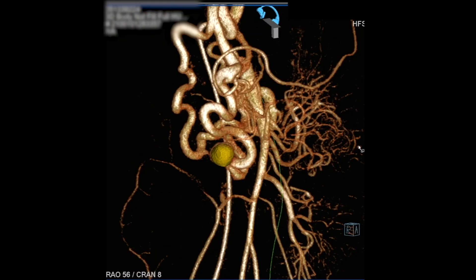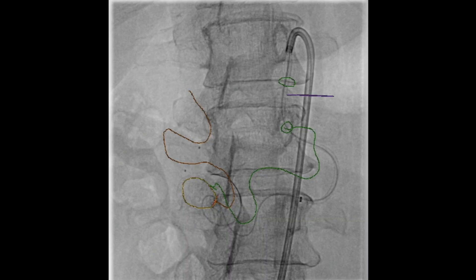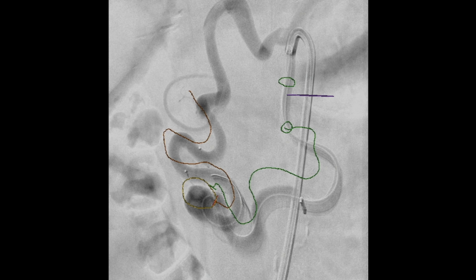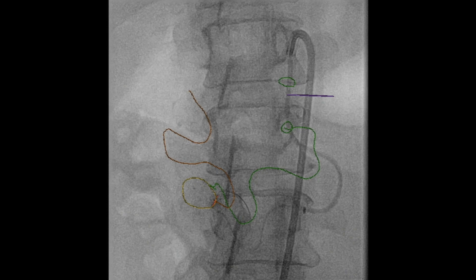Although we were confident that the posterior division looked fairly large, we really did not want to sacrifice the anterior division if at all possible, and that was one of the reasons we took the approach that we did. Many of the techniques you're going to see here are actually derived from treating intracranial aneurysms. We did involve Dr. Landre Diaz, one of our interventional neuroradiologists, in the planning and execution of this, and you'll see that was incredibly valuable.